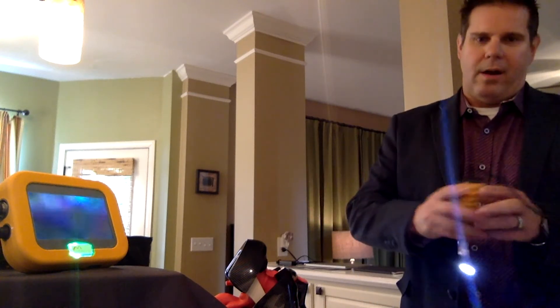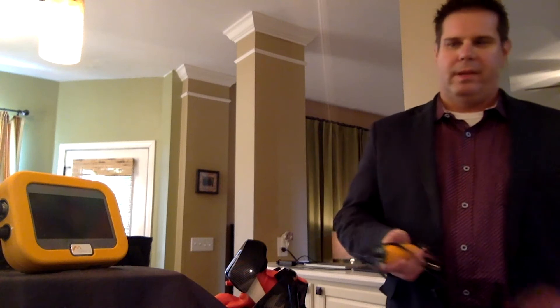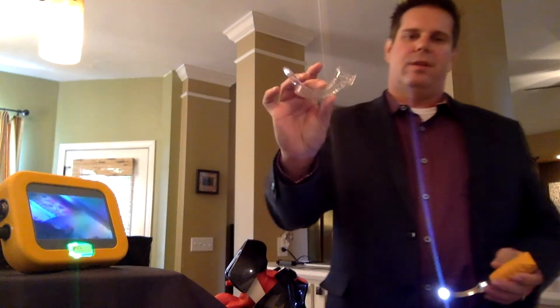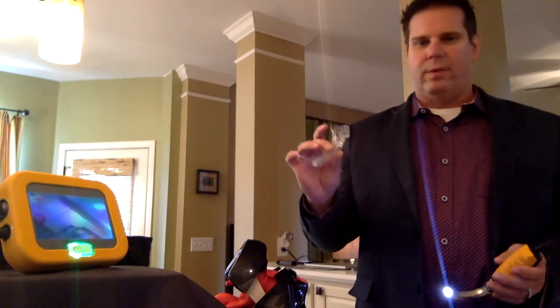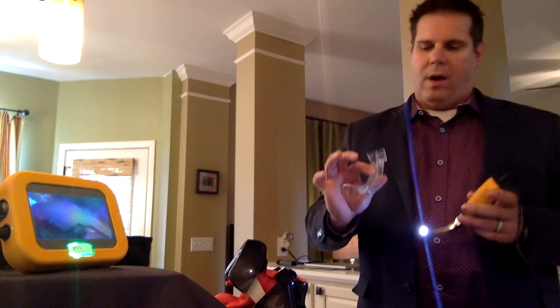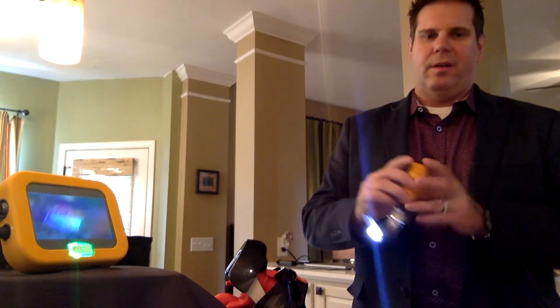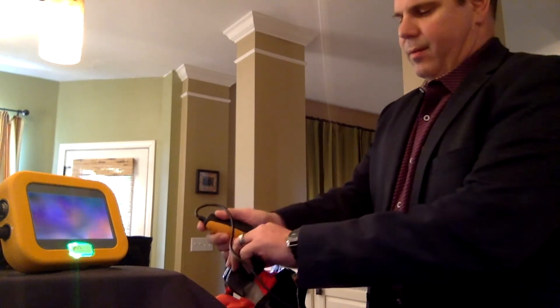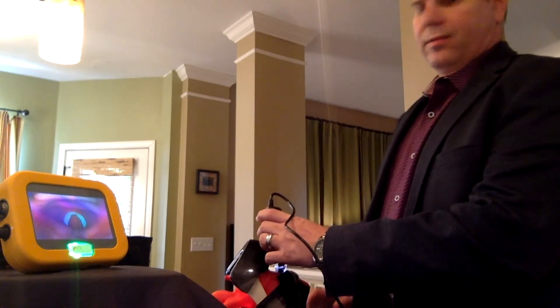To turn it on and off, we just disengage the blade and then turn it back on. To intubate, we're going to use our sheaths — we have a size 3 and a size 4. It's very important that when you're intubating you have a sheath on. Ours only work on the Co-Pilot unit, so they don't work with anything else. We're going to slip that in place and I want you to see how quick and easy I can get to the vocal cords.